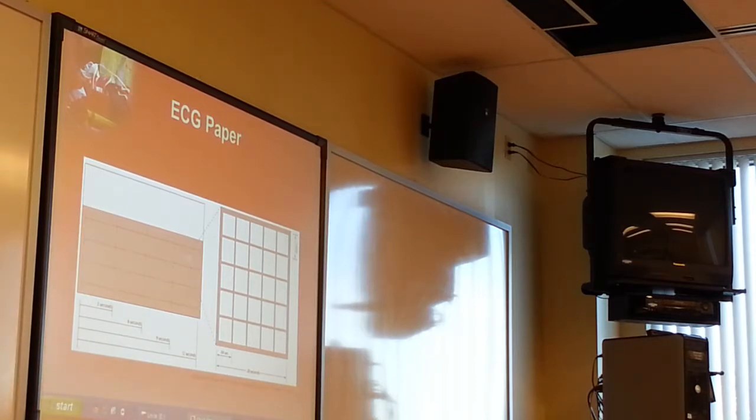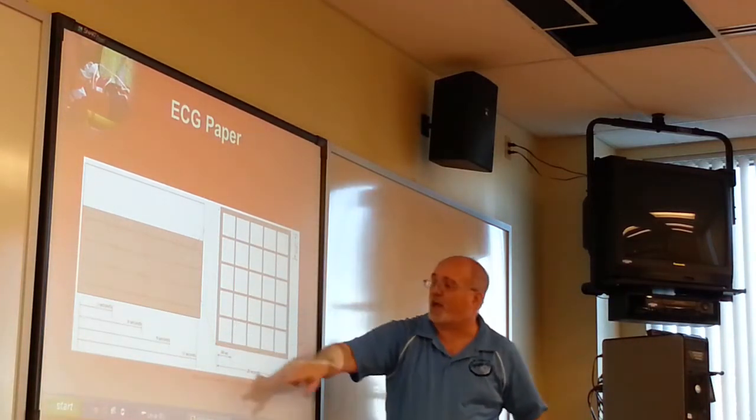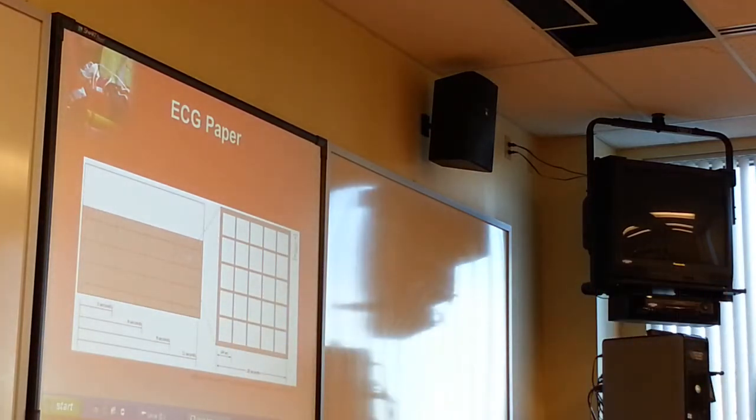Okay? You're counting to see where it is. So this is just a picture of right here. This is 0.04 seconds. Here you go. A large box is 0.20.